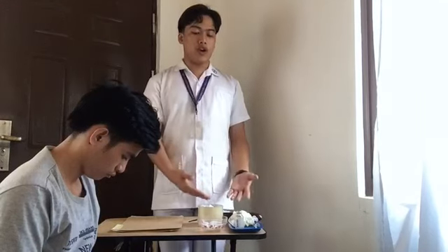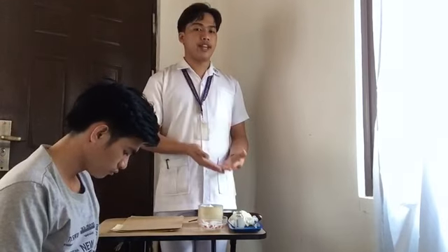So next is organize the equipment. So I already organized the equipment. This is to save time and energy. Next is perform hand hygiene, and this is to observe other appropriate infection prevention procedures. This is to deter the spread of microorganisms. So next is prepare the medication from the ampule or vial for drug withdrawal. So I already prepared the medication from the ampule.